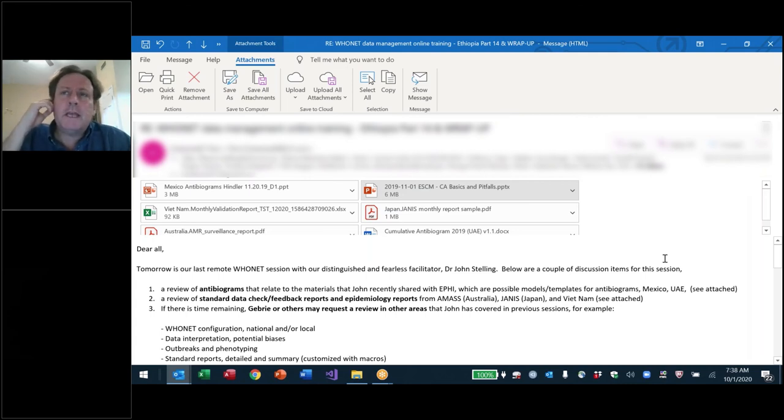We are doing things like per hospital bed size. This hospital has maybe 100 beds. This other hospital has maybe 100 beds. The first hospital takes maybe 50 blood cultures in a month, and the second hospital maybe only takes 10 blood cultures in a month. So this can be very valuable to look at culturing practices.